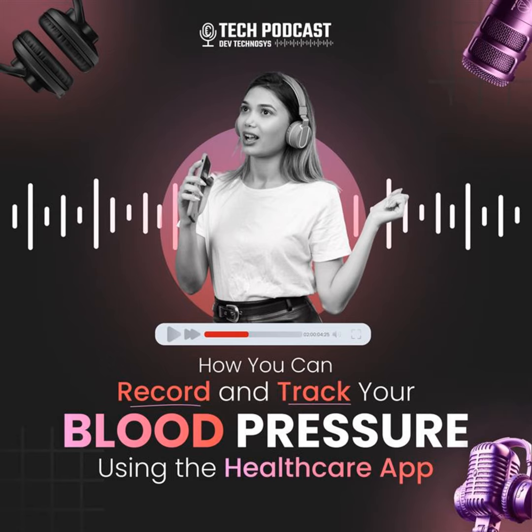That sounds pretty easy. But how do these apps help people actually track the readings over time? Good question. Most well-designed healthcare apps offer visual graphs, daily, weekly, and monthly trends. They highlight highs, lows, and averages. Some apps even flag readings as normal, elevated, or high, based on WHO or AHA guidelines. This helps users see patterns like morning spikes or post-meal increases without needing to interpret numbers on their own. So it really makes the data actionable.